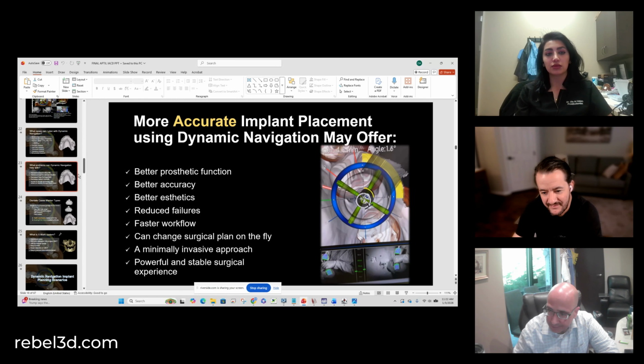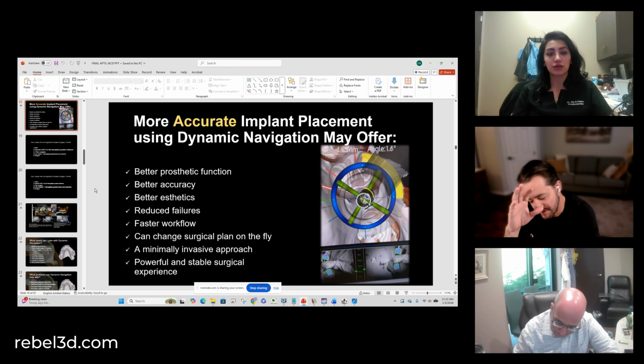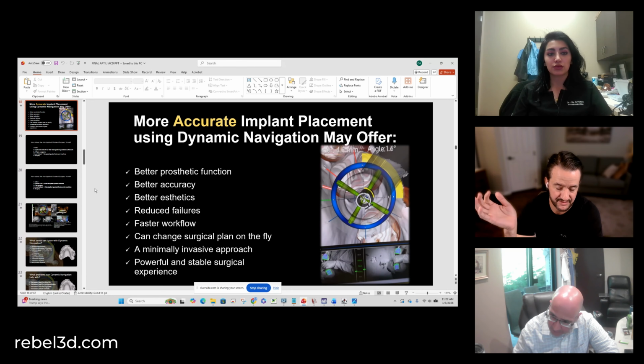For sure. So you have your record taking, and then, doctor, you have your surgical planning. So now day of surgery, how long is a typical surgical procedure, assuming things are going relatively according to plan? For a double arch, are you booking no more than 3.5, at most 4 hours? For a dual arch? Yeah. Half a day? Do you ever schedule two double arches in the same day, or no?